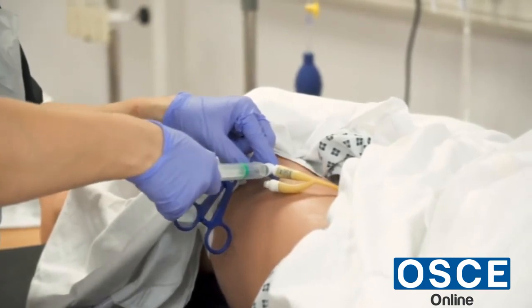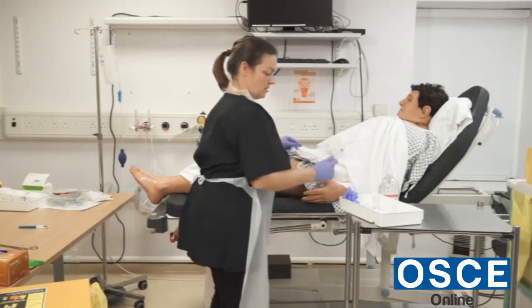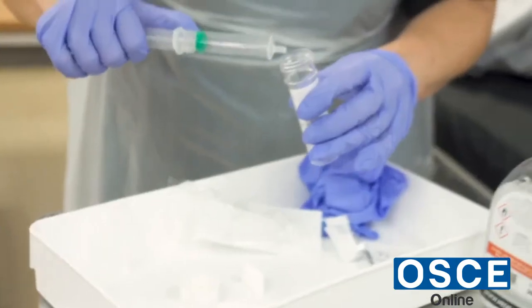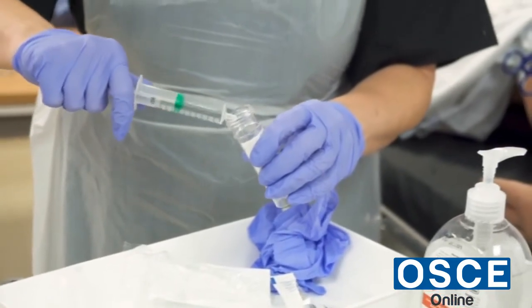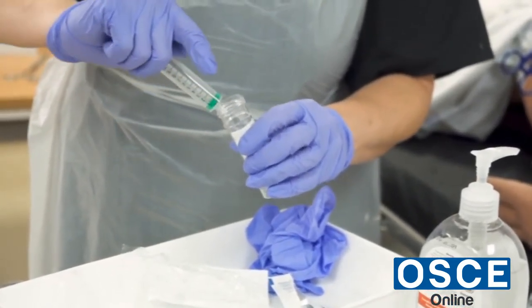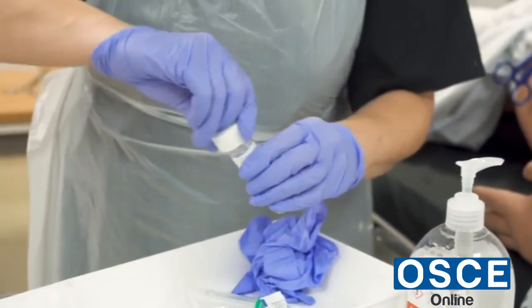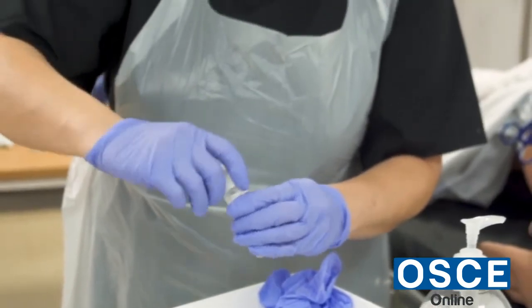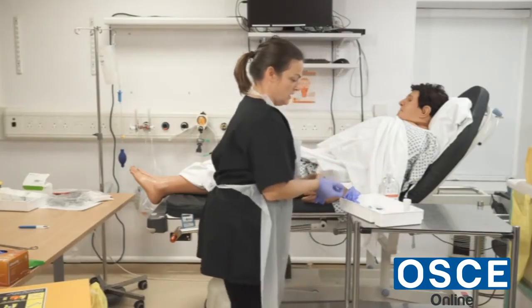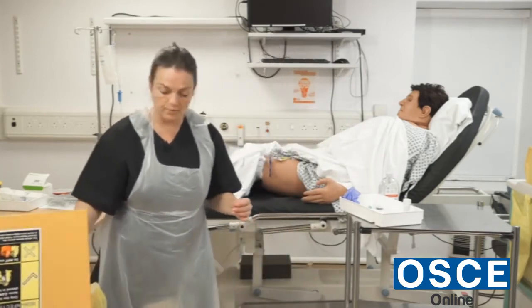I would take 10ml of urine and transfer it over to the urine sample pot, keeping the lid facing upwards. Don't let the end of the syringe touch the inside of the bottle. Put the lid on so it's nice and secure with no leakage.